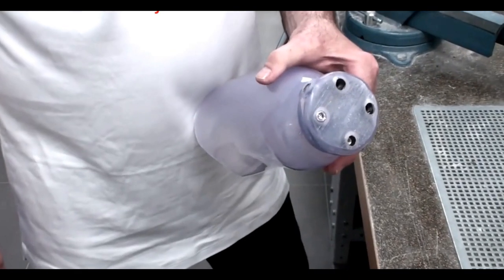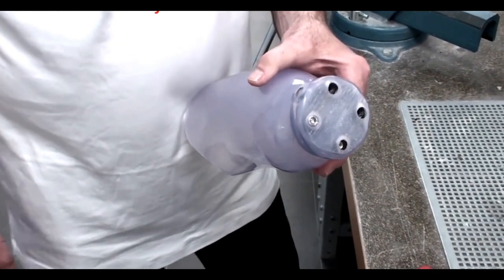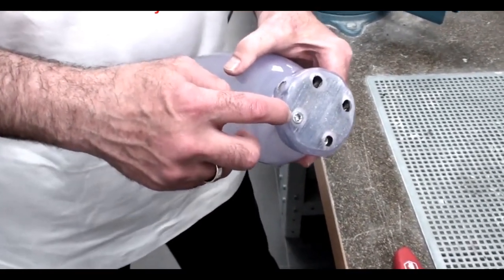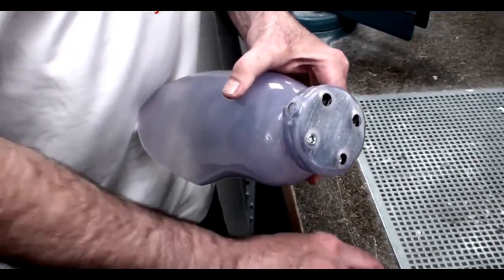To prepare the distal end of the DVS socket to receive the components, grind the surface flat to expose the top of the hex or cap screws. Then remove them.